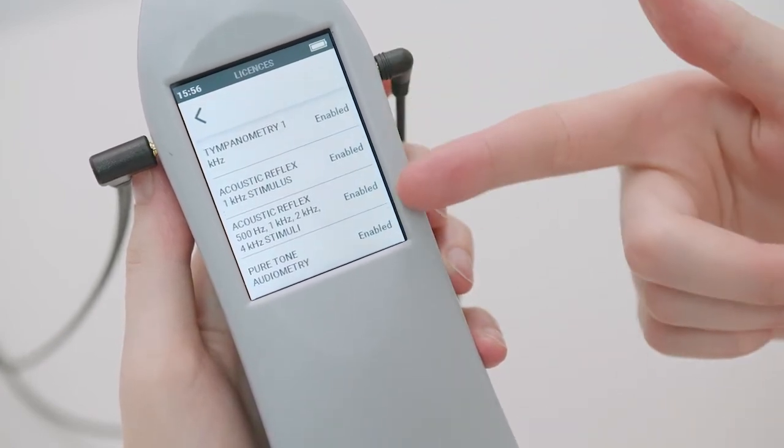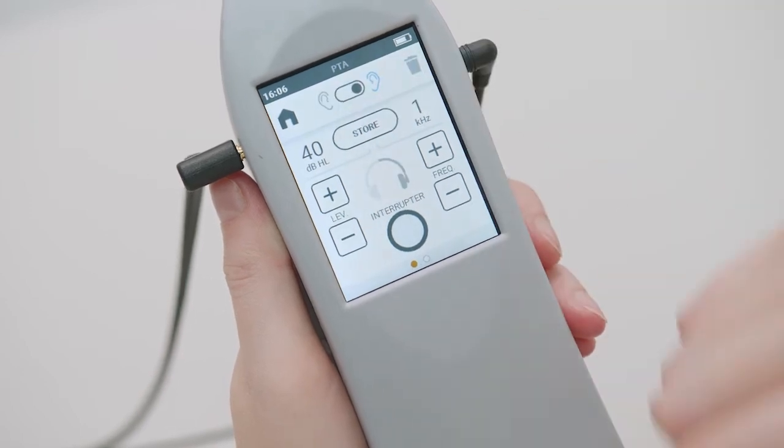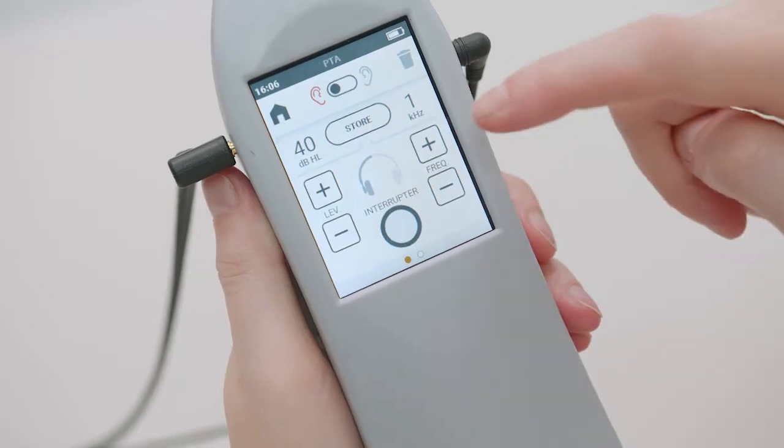The interface is pristine yet presents everything you need to conduct a screening audiometry. By pressing the ear icon you can select which side to conduct the test on: red for right, blue for left. In manual audiometry, the user can select the frequency and intensity of the stimulus.